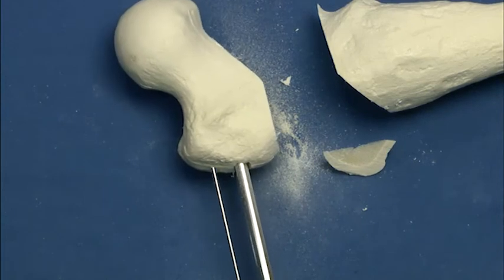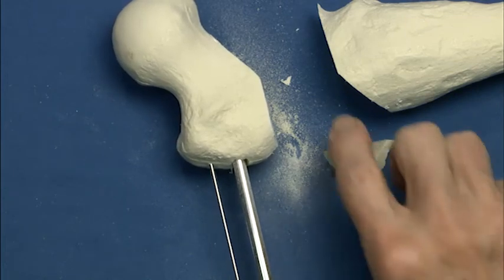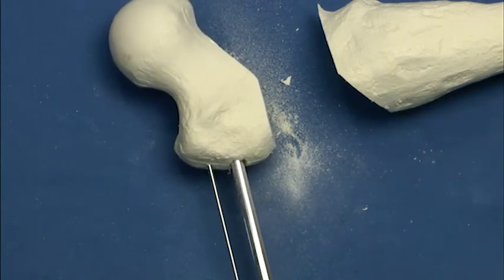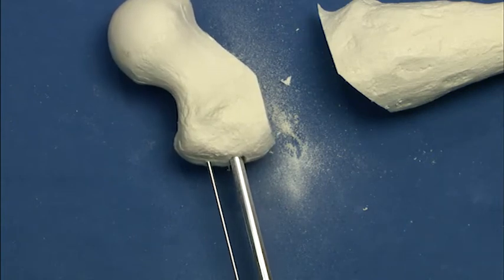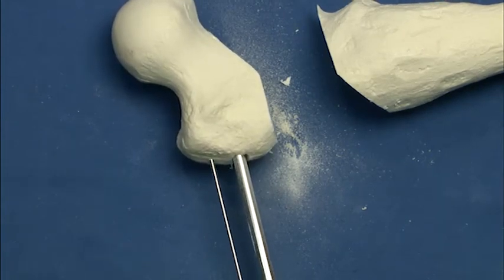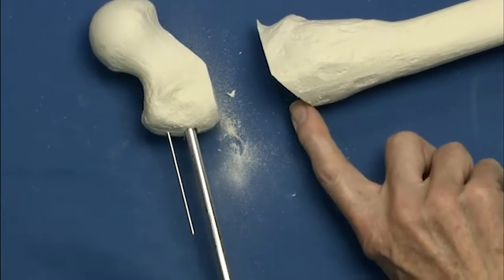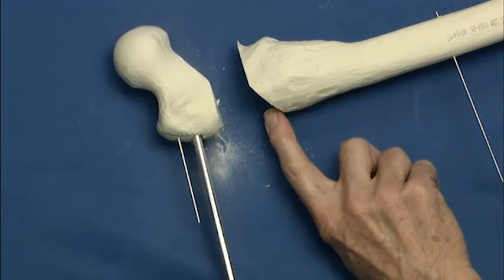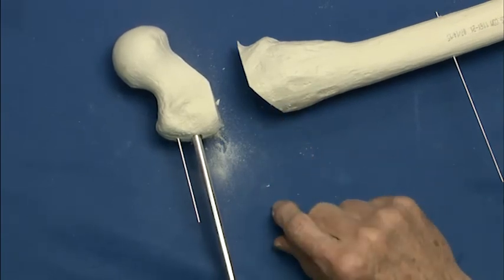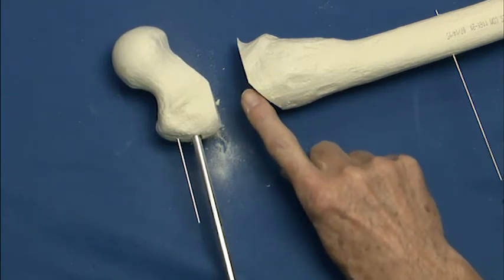And theoretically, when we match these up with the blade in place, we should have now compensated for all three planes. So that last closing wedge is from the anterior cortex, the proximal segment, which corrects the sagittal plane. We've compensated the horizontal plane with this cut, derotated. And our length determination has been based on offset and the angle of the correction, as well as how far across we went here.